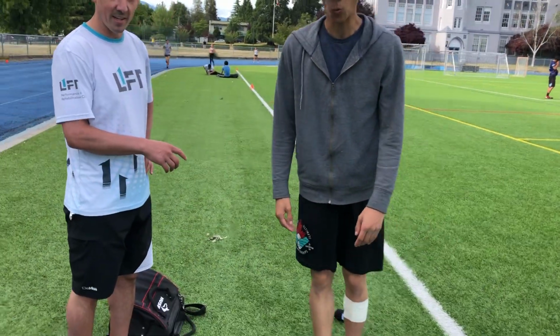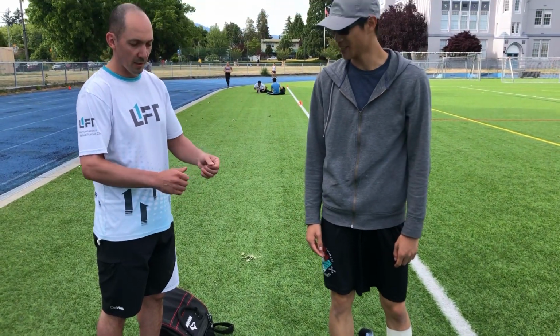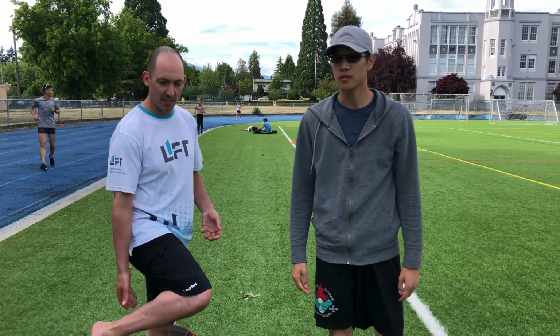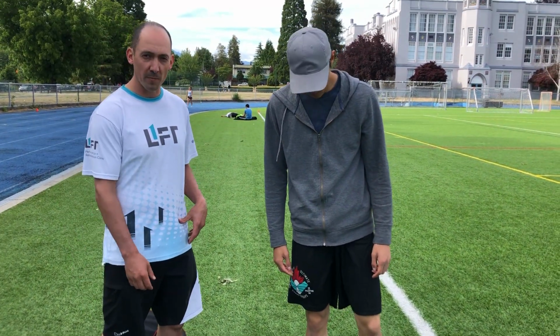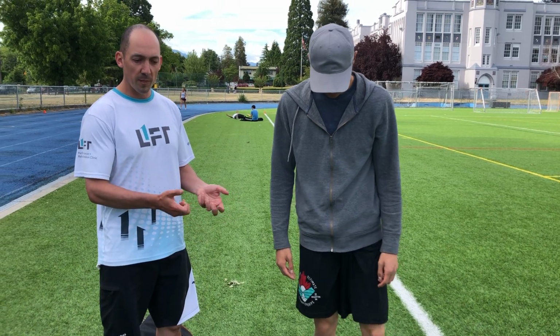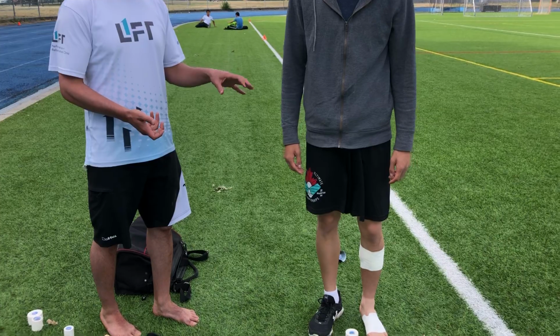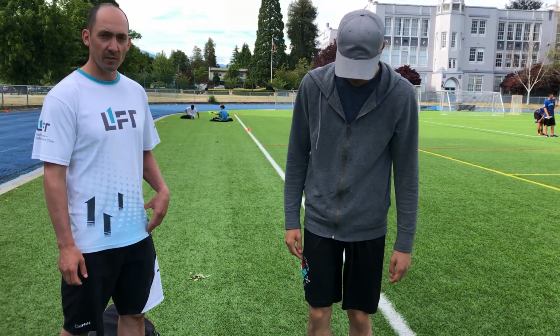But this is intense, right? I showed you a very intense version, applying a lot of tension on there. That might be appropriate if somebody has pretty severe pain and they're really struggling with producing pressure to jump. In this case, you might be able to significantly alleviate their pain by creating a false Achilles tendon. Okay, so that's what we want to do.